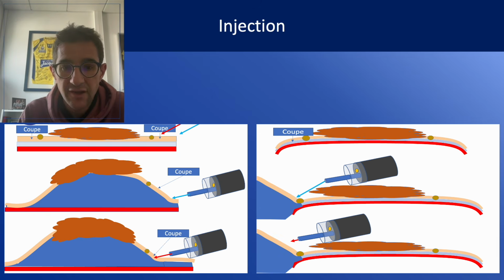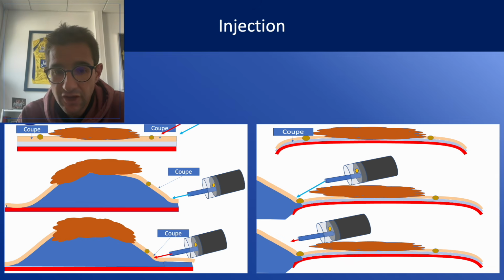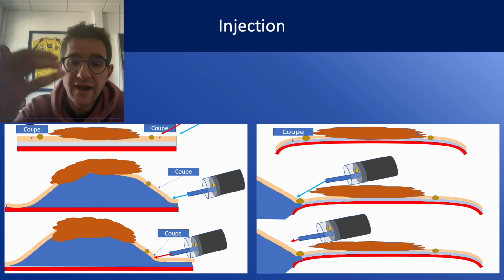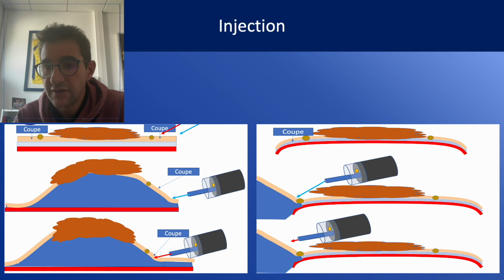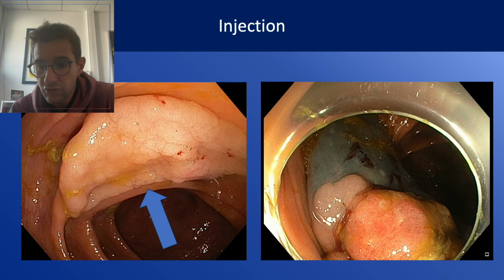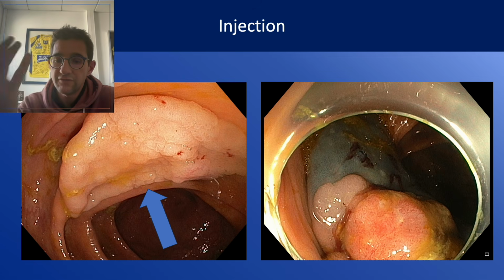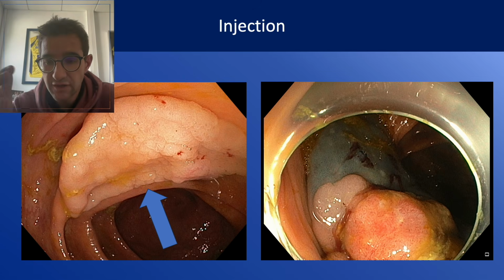In this case, if you inject at the anal side of the lesion, it will turn, and it will become very difficult to do the oral edge incision. So, for me, in this lesion, you should inject first outside the lesion, at the oral side, to turn the lesion to face you, and therefore to have an incision which is really easier, by doing first the incision at the oral edge, making the mucosa grow toward you, turning the lesion facing you, and therefore you will have a more effective incision in direct viewing.